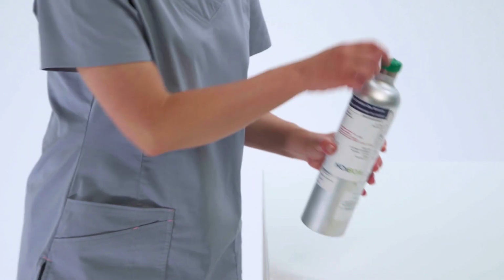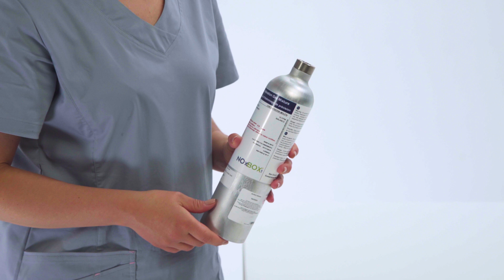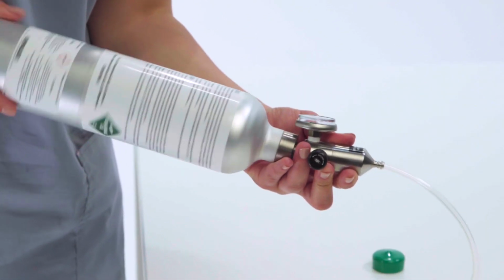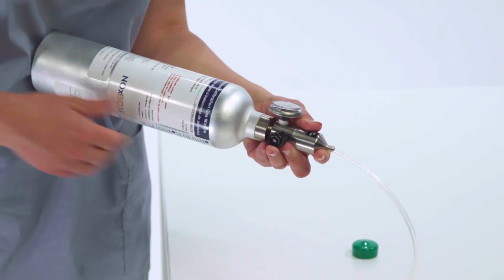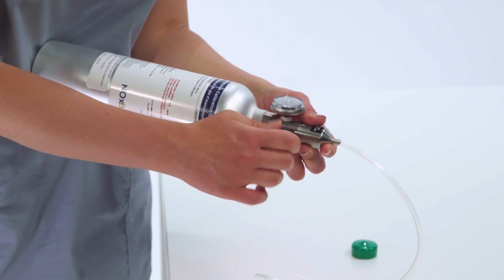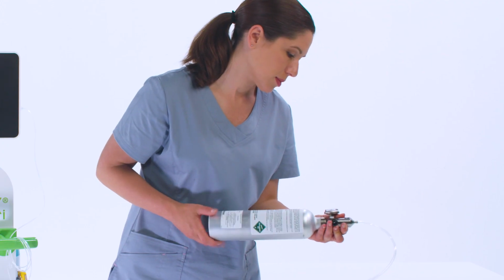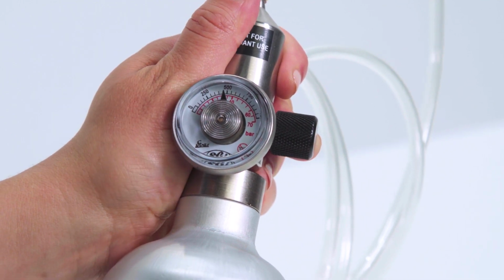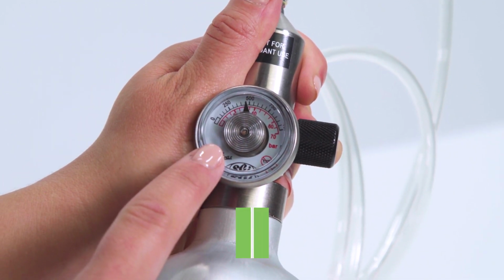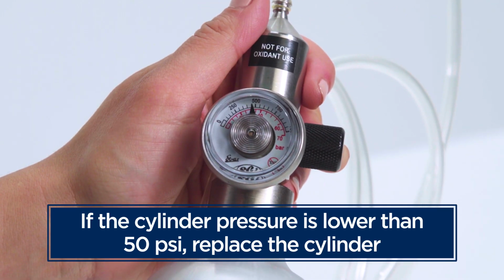Before connecting the regulator to the cylinder, remove the cylinder dust cap and verify the sealing O-ring is in place and free from damage. Connect the regulator to the cylinder by screwing the cylinder clockwise into the regulator. Close the regulator valve as soon as you hear the gas flowing or see pressure indicated on the gauge, and continue to tighten the cylinder to the regulator fully. To complete the calibration, you must have pressure of at least 50 psi or more. If the cylinder pressure is lower than 50 psi, replace the cylinder.